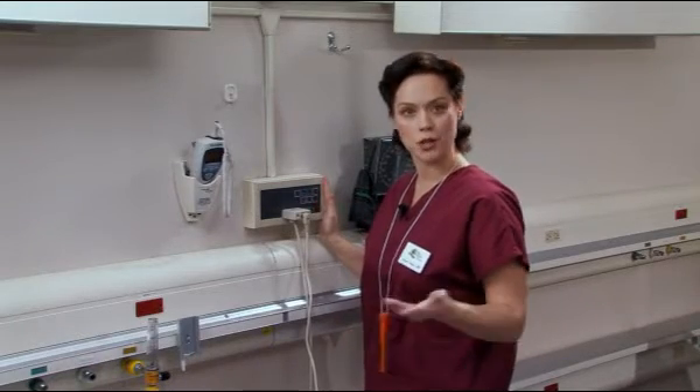On most nurse call systems, you will have to push the reset button in the room when you unplug or plug in new equipment.